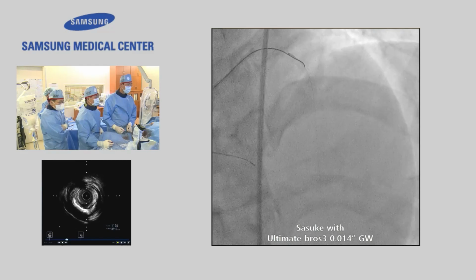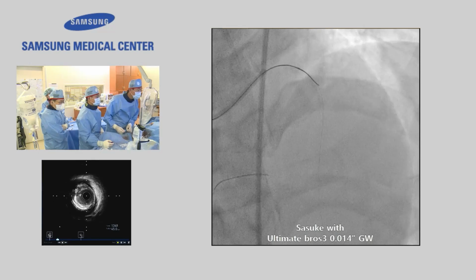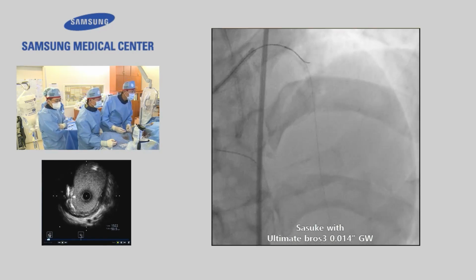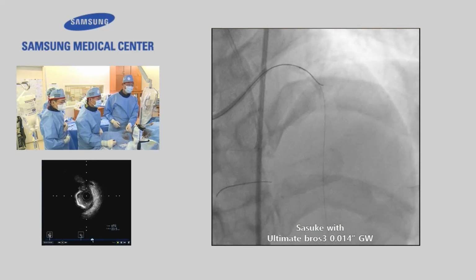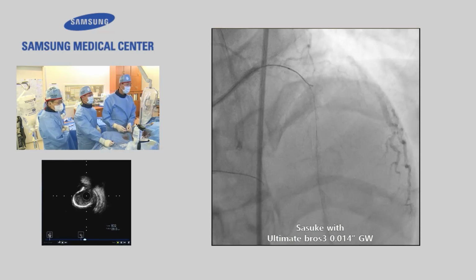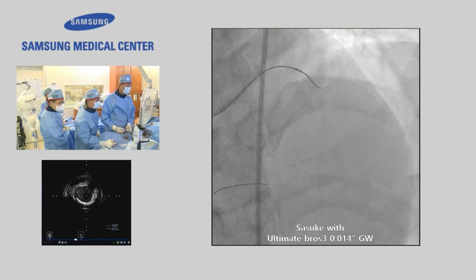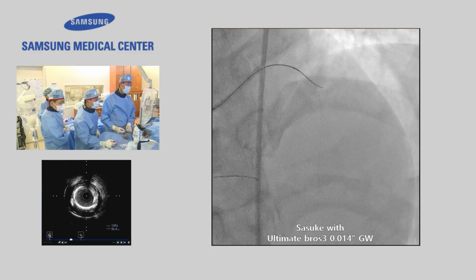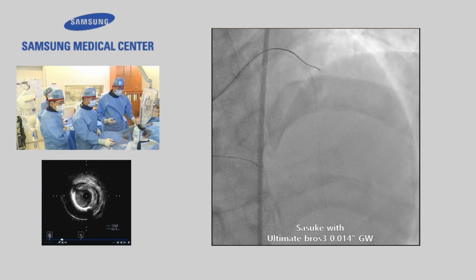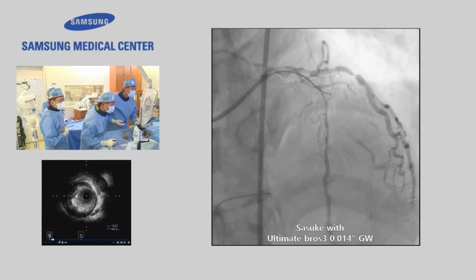Okay. No need to inject contrast. That's a little lower position of the calcium. There was some resistance here, so I'll try to rotate clockwise. Yeah, there was some progress. Yeah, seems I'm not sure this is inside of the plaque. Anyway, I would like to get Andrew here. Seems nice.